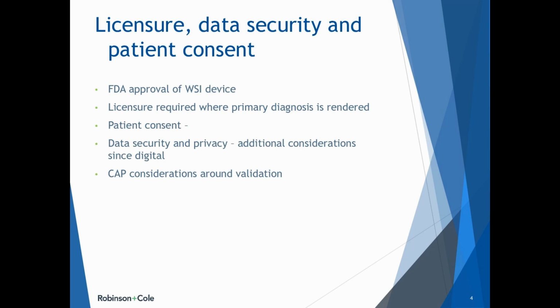It's also really important to perform a privacy risk analysis as you are digitizing and having this on a network, and that it's very secure and you're doing penetration testing and all of the other good privacy and security practices, just because there is a lot of data here that's now digital and existing out there. So those are all things to think about, and then the last part is also any state regulations regarding what is required, even if it is digital.